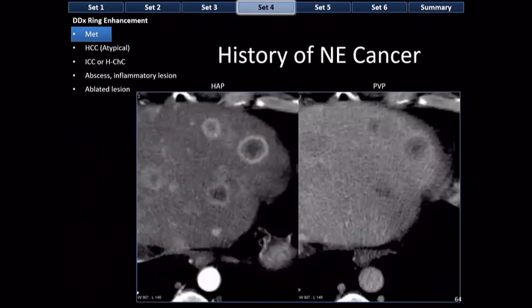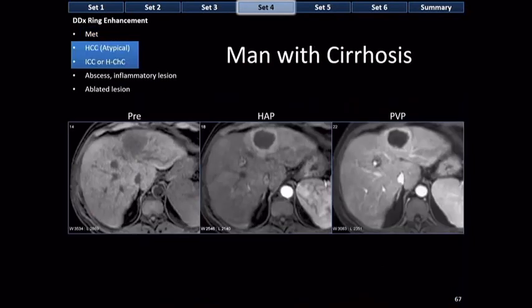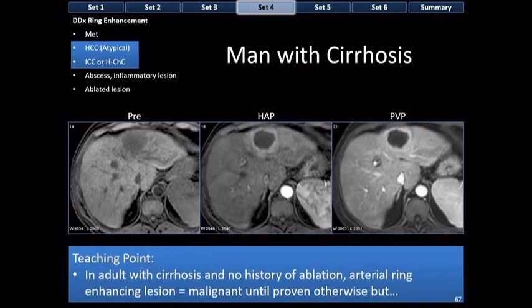Why do metastases have ring enhancement? In this case, all the lesions are metastases — notice that small ones are diffusely enhancing and homogeneous, but as they get bigger they start forming rings, and as they get even bigger the rings become more sharply defined. As metastases grow, they develop central ischemia and necrosis, developing a target or ring-like configuration. In the setting of cirrhosis, a ring-enhancing lesion means thinking HCC or cholangiocarcinoma variants — not metastasis.